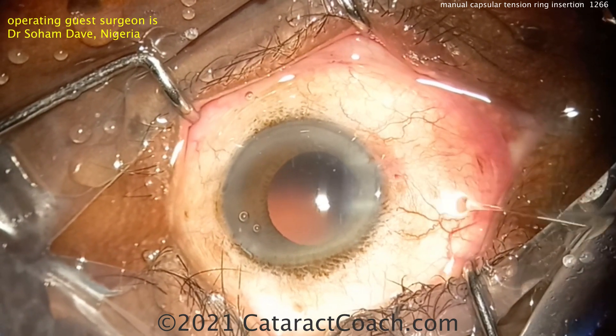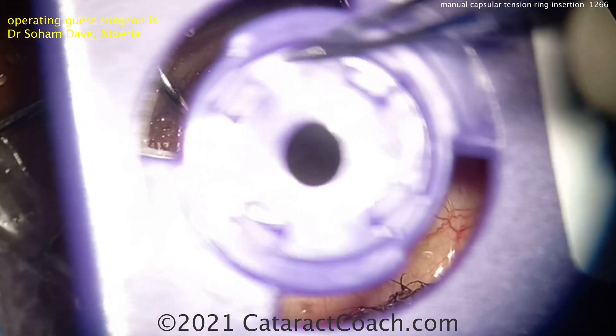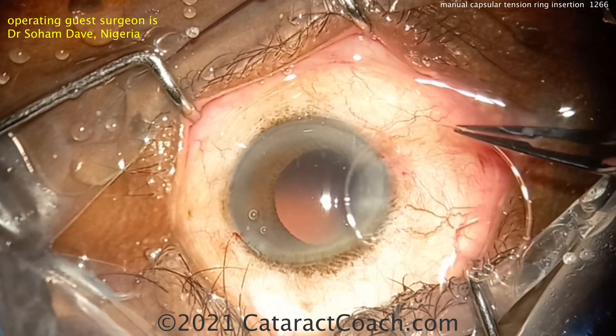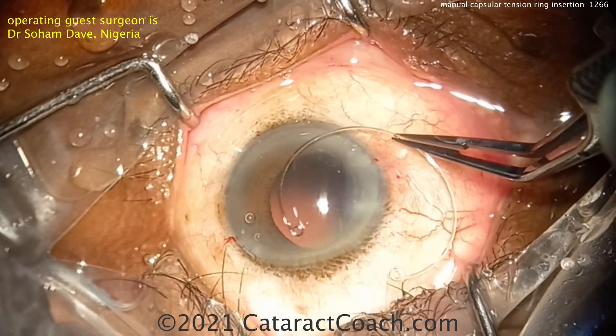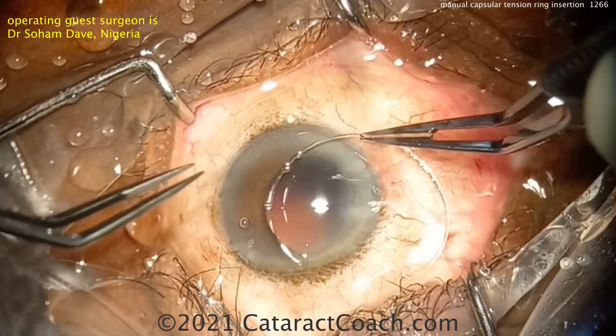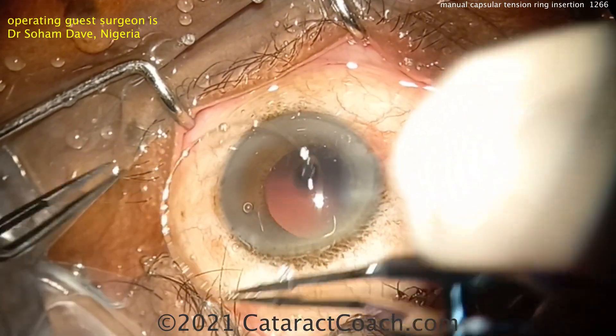With this mild zonular dialysis or zonular weakness, it may be a good idea to get a capsular tension ring in. Get a good fill of viscoelastic first. Also try to remove the cortex first, because the CTR can trap cortex up in the capsular bag equator. Here's a CTR — it looks so much bigger, but it's springy and exerts that outward force.